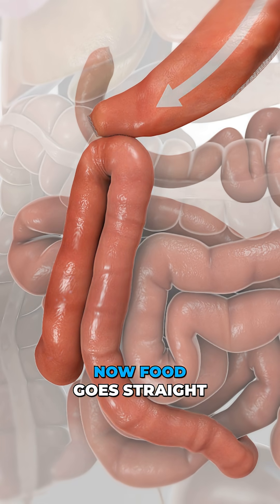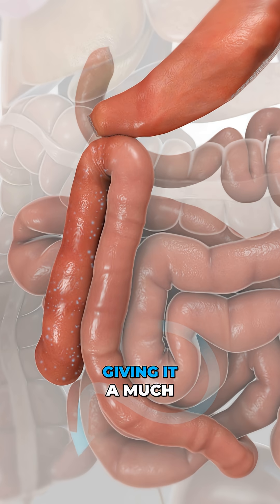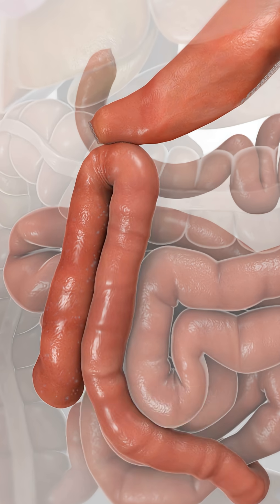Now, food goes straight from the stomach sleeve into this lower intestinal segment, giving it a much shorter route to the colon.